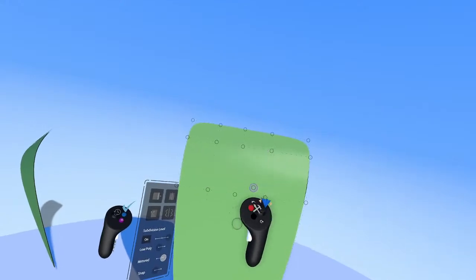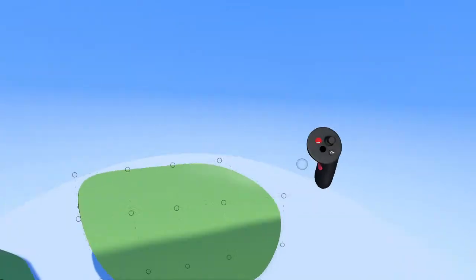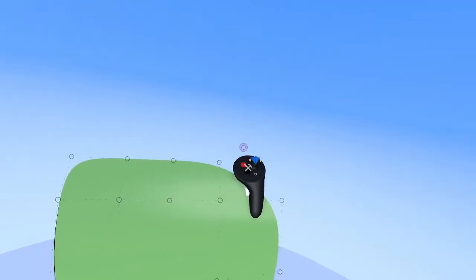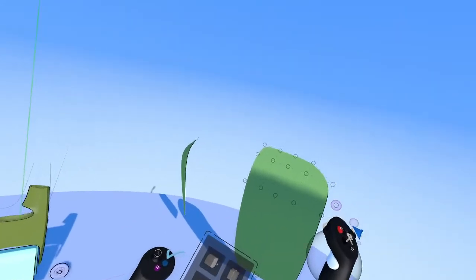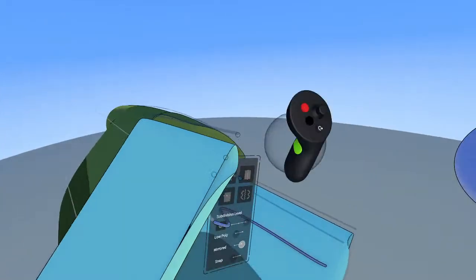So let's do it here. And you can see that the geometry is compensating for that. Now let's do it on this edge over here. Delete this edit point. You'll see it's just going to make a triangle for us here. Now triangles are not ideal. They're not what you're shooting for, but you have the flexibility to, in a compromised situation down here, make a triangle. So that's what I'm going to do here.